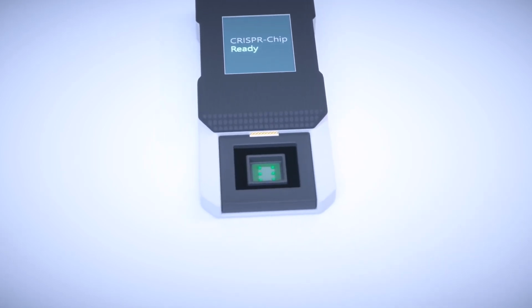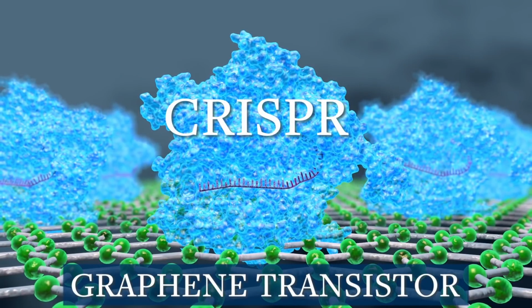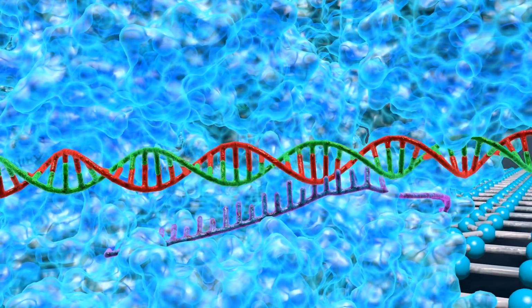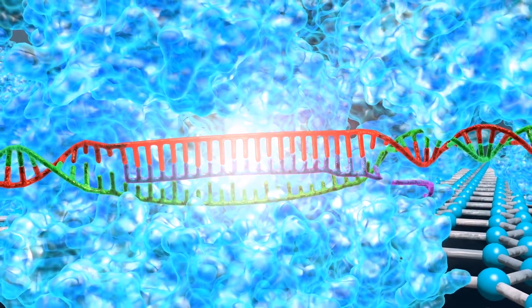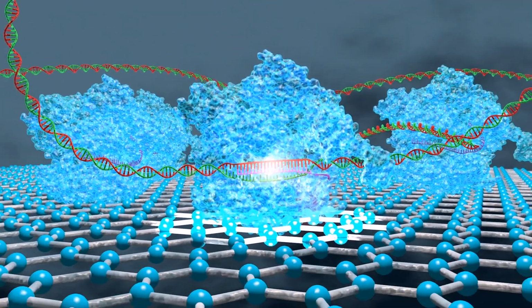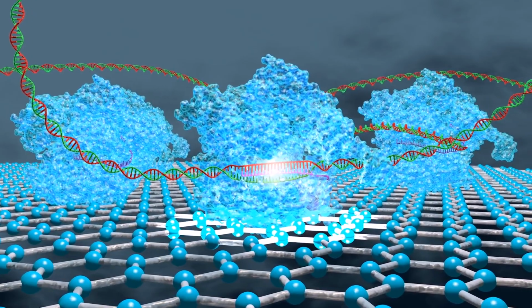CRISPR-Chip is a handheld device that combines thousands of CRISPR molecules with a graphene transistor. Researchers designed CRISPR to scan through DNA and find specific genes or mutations, while the transistor is super sensitive to electrically charged materials, like our DNA.